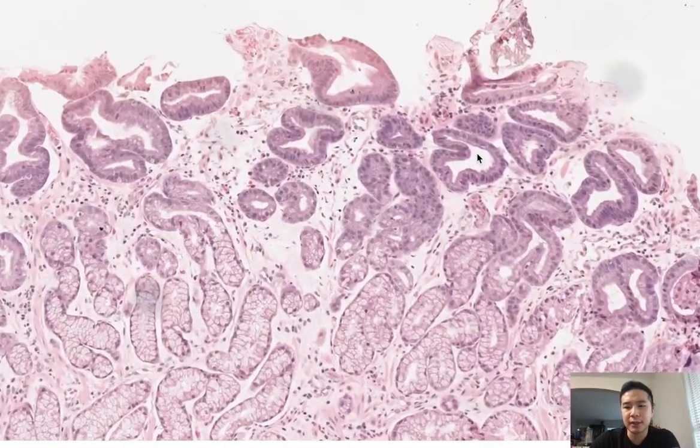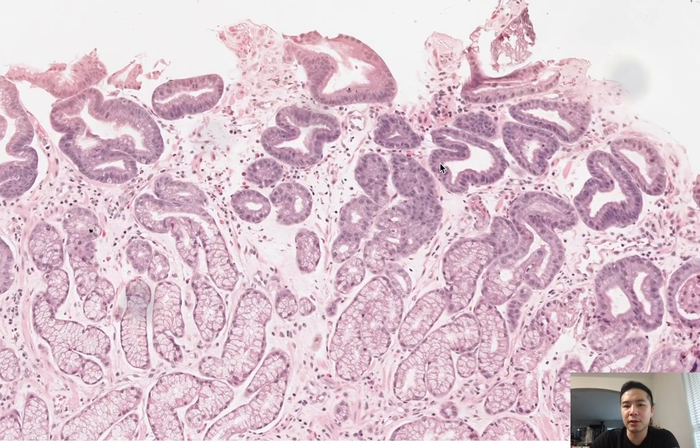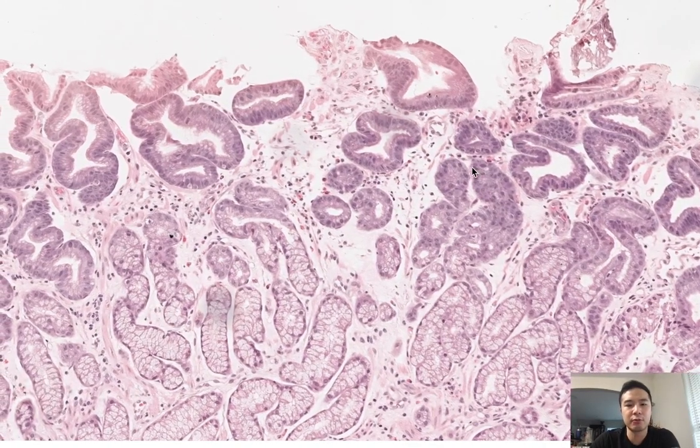So here, appreciate how you lose the foveolar mucin, okay? And you have a higher NC ratio, but it's not atypical. They're all pretty uniform. There's no loss of polarity. So that's what you see in reactive gastropathy.